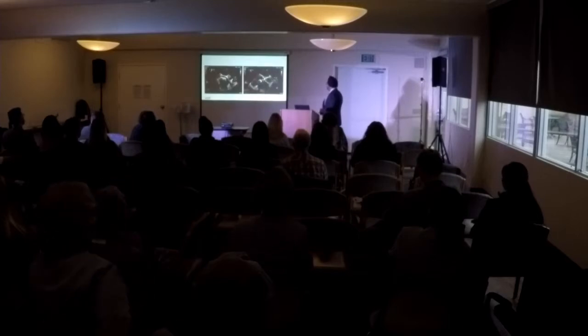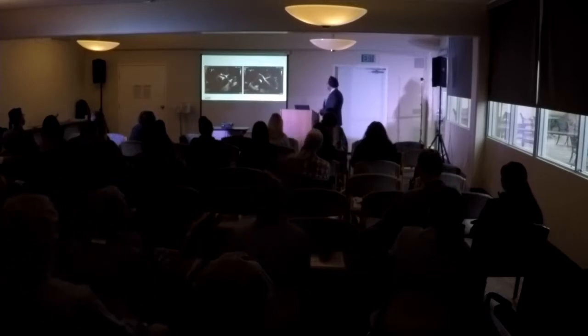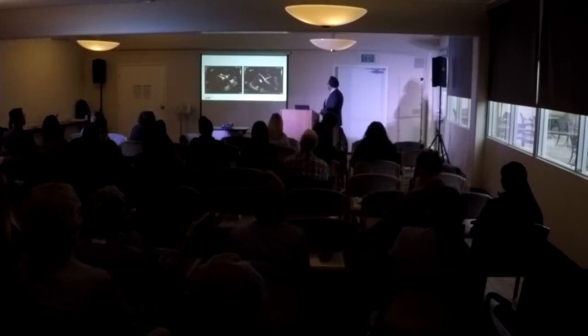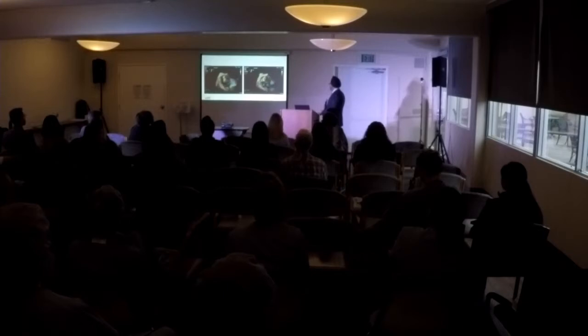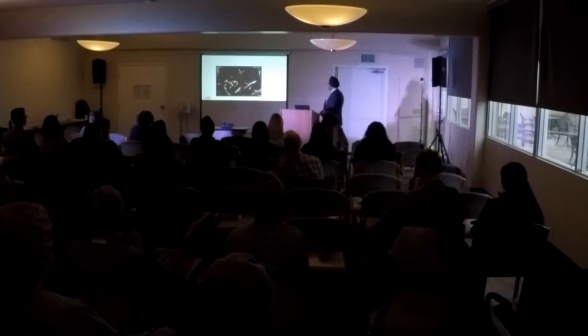The clip then comes in, similar to the mitral clip. We bring it down to the tricuspid valve. We can position it, orient it in multiple different locations and manners. We put color on to make sure we're at the source of where the regurgitation is coming from. This is the clip opened above the valve. We align it and position it. Now we've brought the clip below the valve.